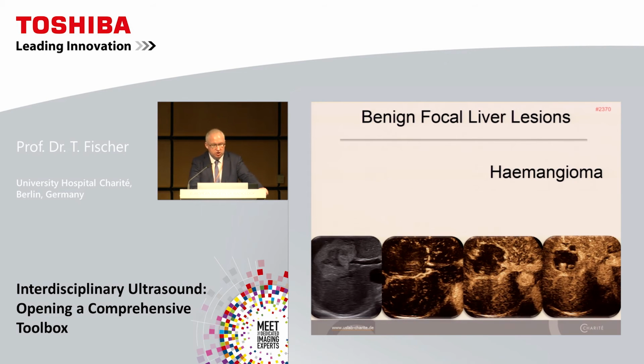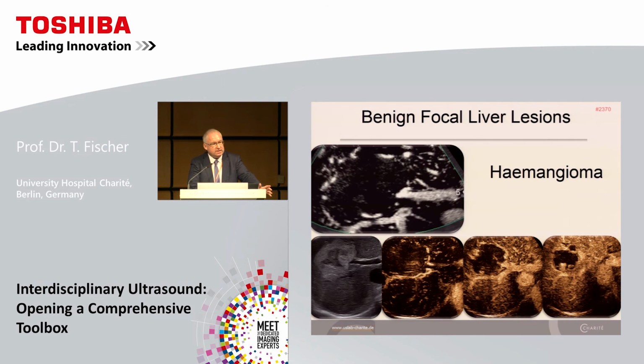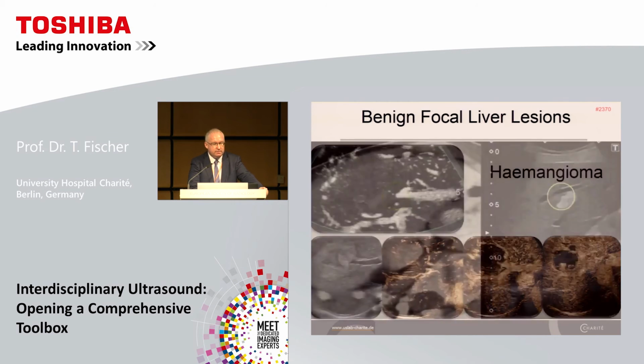Coming to a hemangioma case, of course, we can do a lot of contrast applications, but look at SMI. It looks quite similar to the arterial phase after contrast application. So in some real clear clinical cases, I believe we can skip contrast application if this is a clear hemangioma with such an enhancement pattern.